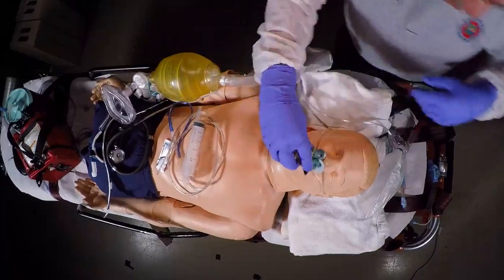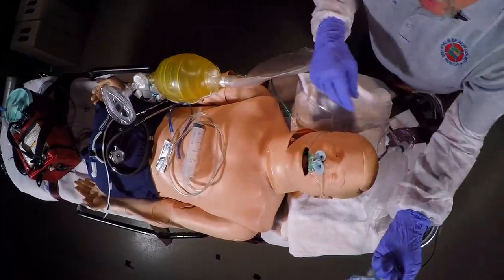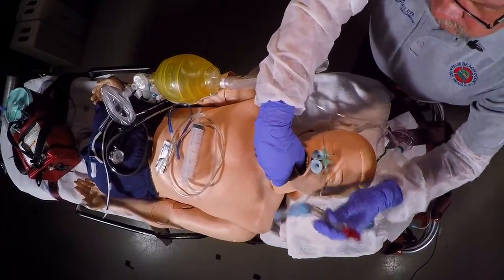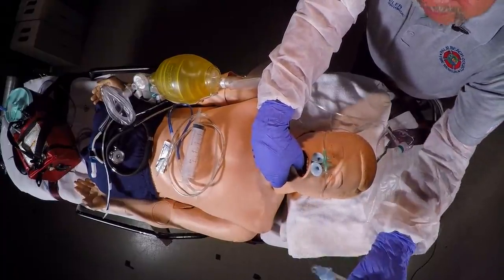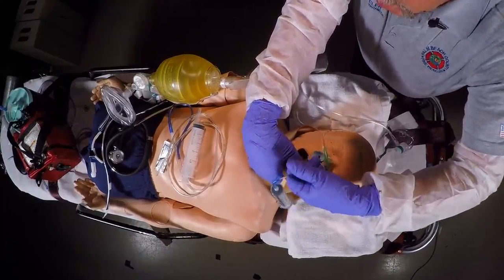We go ahead and remove the oral airway, and with our dominant hand, we want to hold the King airway. With our non-dominant hand, we want to do a chin lift, and we want to insert the King airway midline and rotate it as we put it in.